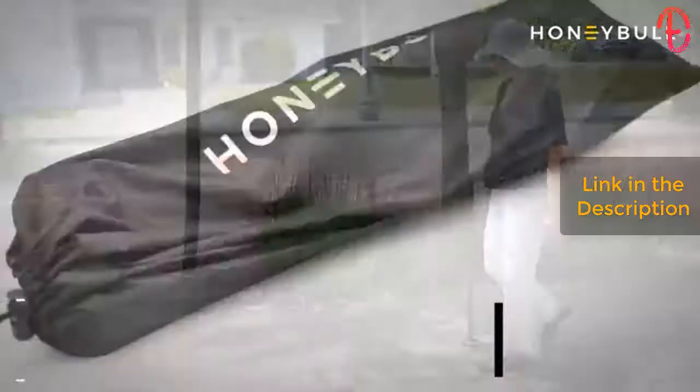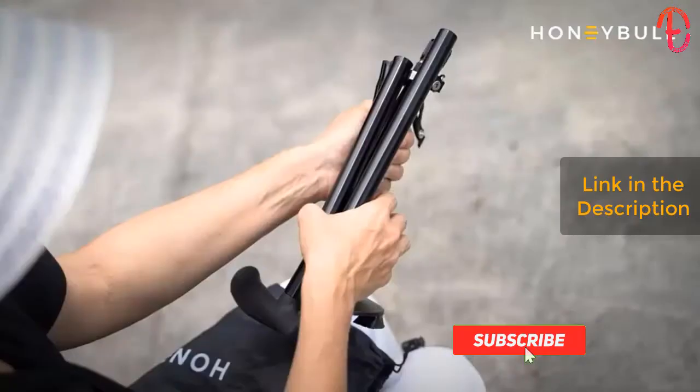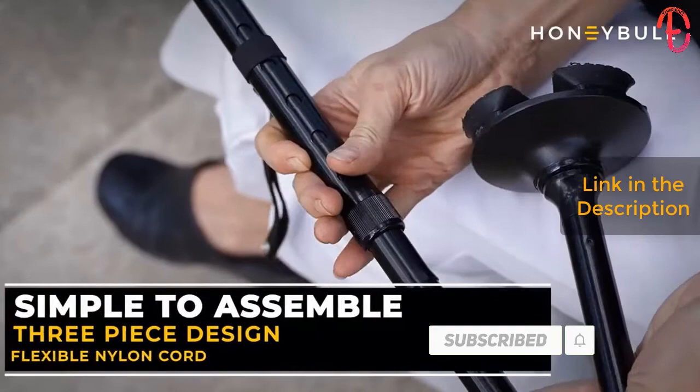HoneyBull walking cane for men and women. This cane is perfect for seniors, elderly, and injured persons. Your HoneyBull walking cane comes in this convenient carrying bag and is easy to assemble.